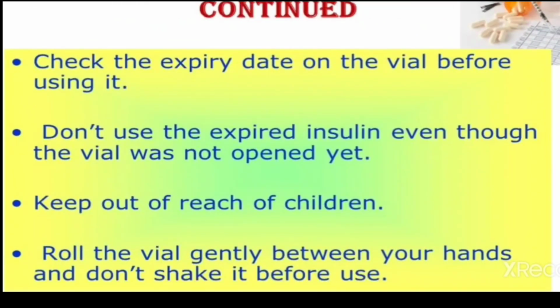Then check the expiry date on the vial, which is very important before using it, and don't use expired insulin even though the vial was not opened, and keep it out of reach of children. Then roll the vial gently between your hands and don't shake it before use.